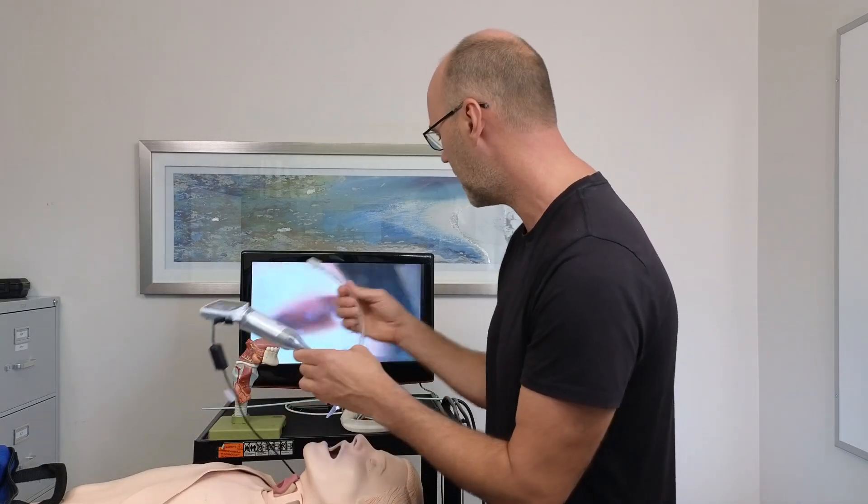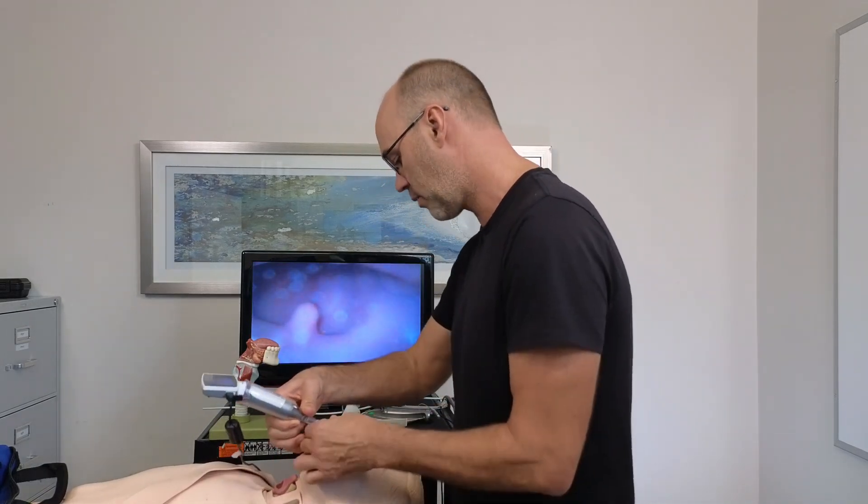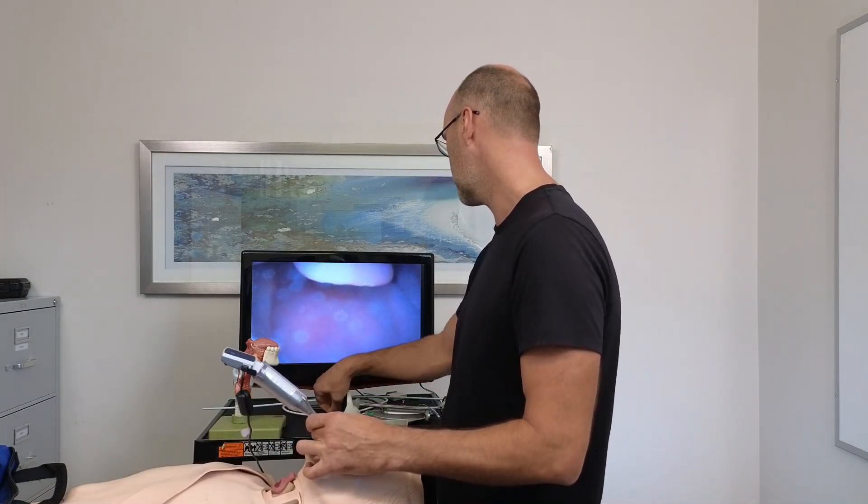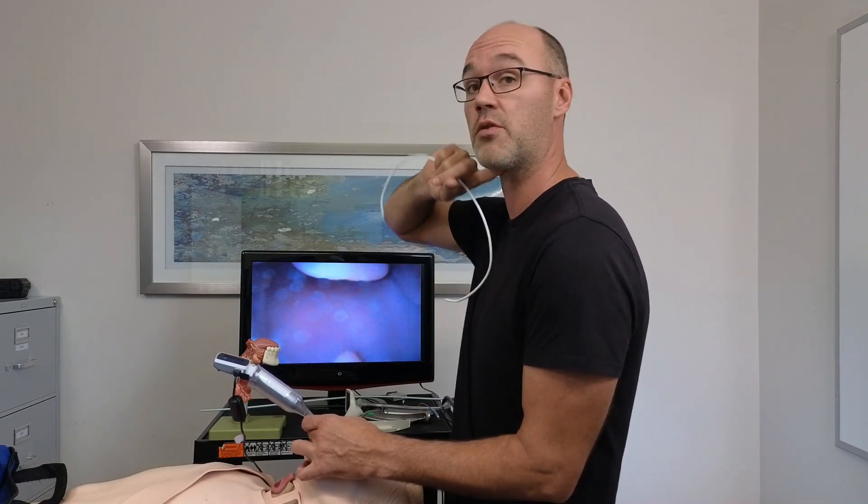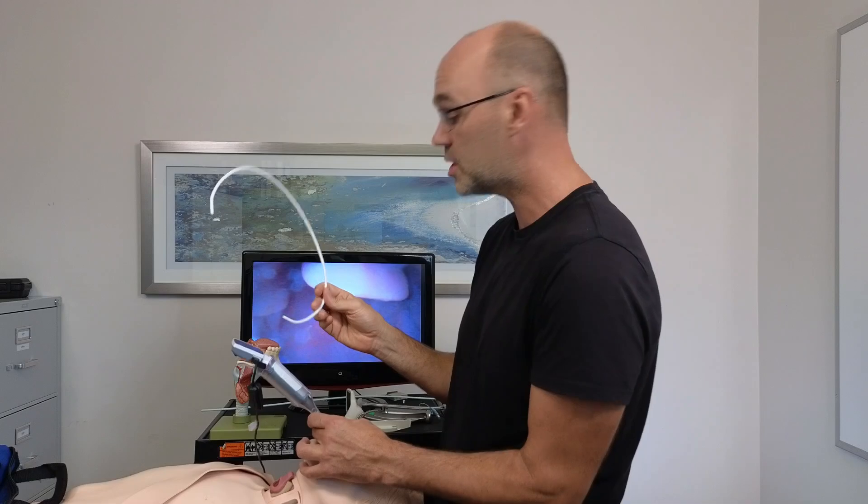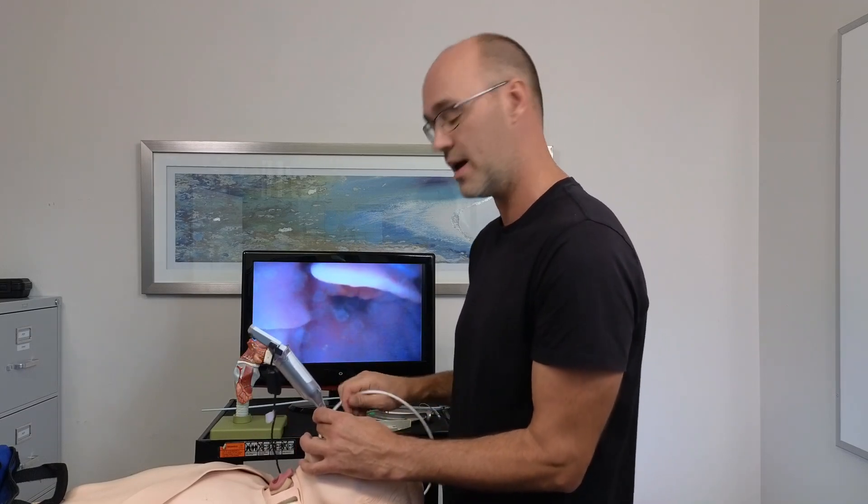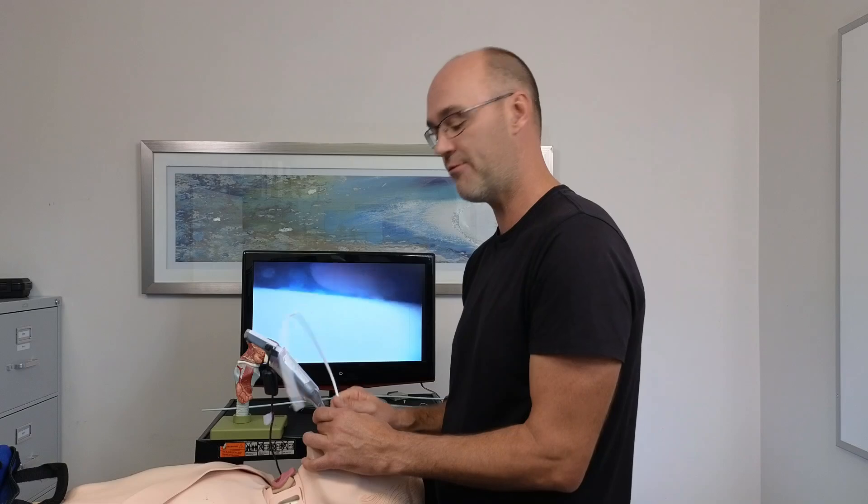With the hyperacute angle, we're going to look in the mouth, insert the blade, rotate around. Now, I can also use the hyperacute angle if I was having trouble and the patient was particularly anterior. Let's say the laryngeal, the thyroid cartilage was really close to the base of the tongue, so not a lot of space when we measured that 3-3-2 and evaluate as part of LEMON. So we have a really superior laryngeal structures. We could use a bougie, which works really well. And another thing that you can do to help advancing tubes is you can get way over into the right side, into the right cheek. That's going to allow us to have less of a curve as we head into the trachea. So you can have an assistant pull the cheek out for you.